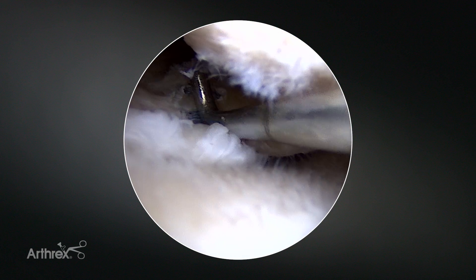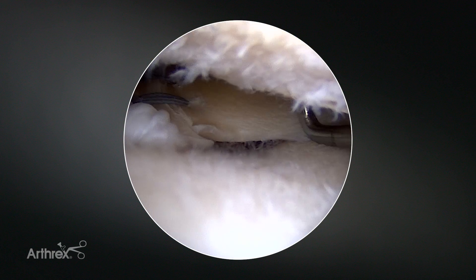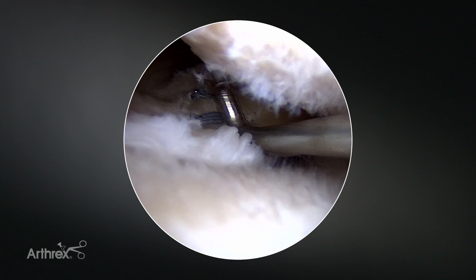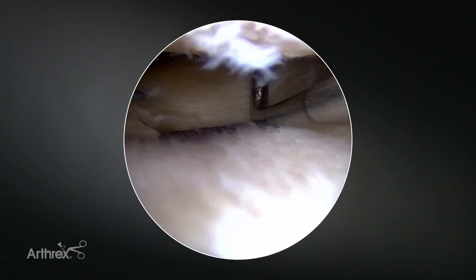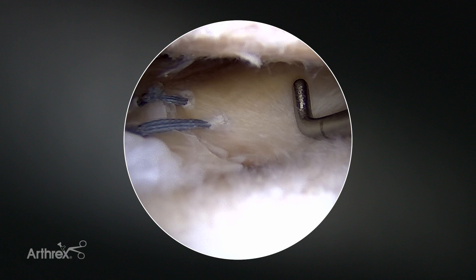There's any number of configurations you could use on this tear. And like I said, it really lets you address — with all these different angles — any type of meniscal tear anatomy that we might see. There's a pretty good view of that repair.